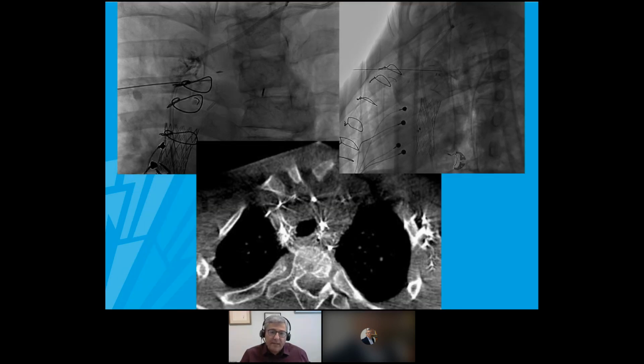So what we did here, again, we did the opacification from the groin of the thoracic duct, and also these hypertrophied lymph nodes in the mediastinum, which are in connection with the lymphatic duct. Initially we did this with Lipiodol, but today you can do this also by MRI. And again, the same technique with a spinal needle. We do the puncture of a groin lymph node, and then we slowly inject 5 cc, or at both groins.